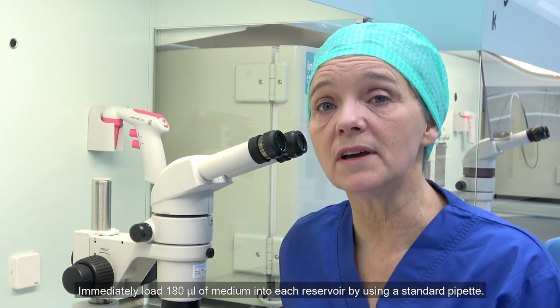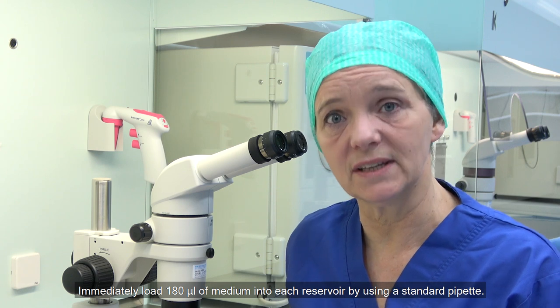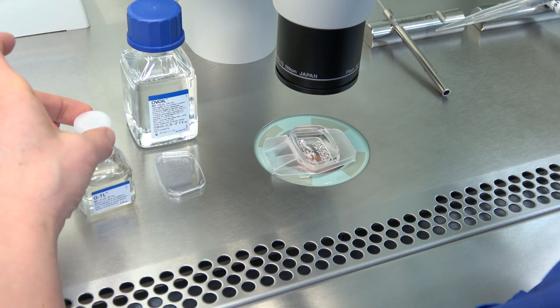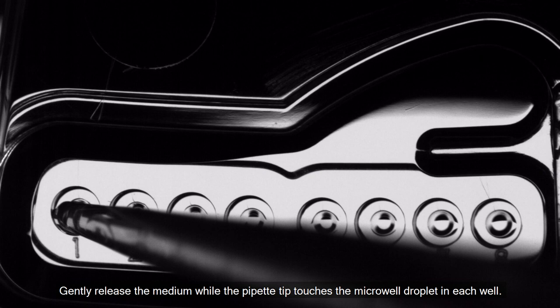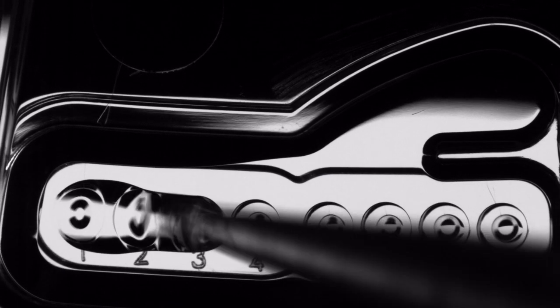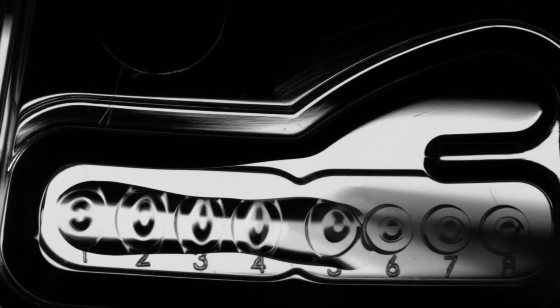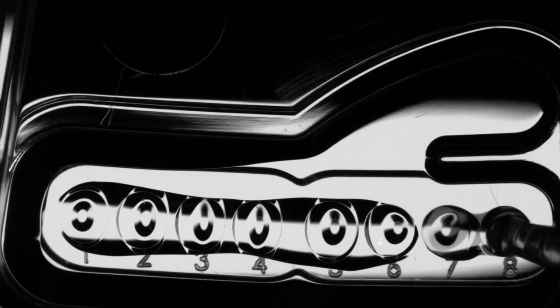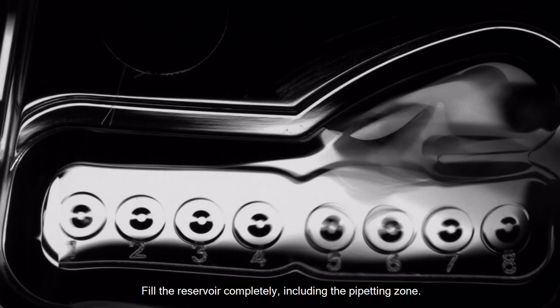Immediately load 180 µL of medium into each reservoir using a standard pipette. Gently release the media while the pipette tip touches the micro well droplet in each well. Fill the reservoir completely, including the pipetting zone.